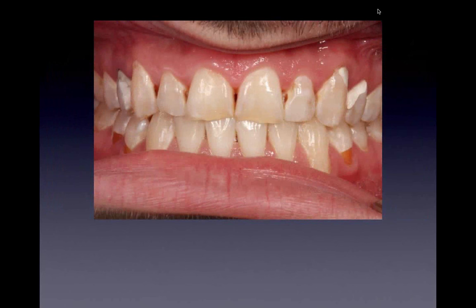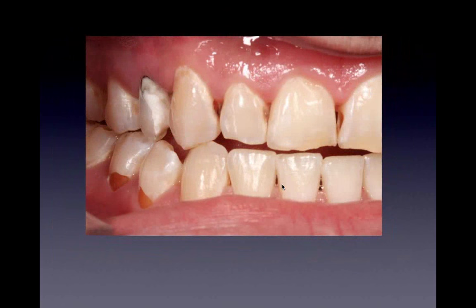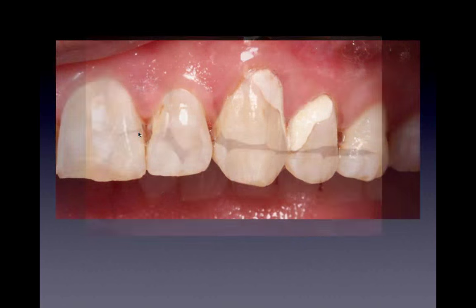Here we have a multiple caries patient. This is multiple units we're doing here. This is where I use the rubber dam. When I'm doing multiple units is when I put the rubber dam on, and we have a lot of decay to get to. We'll go ahead and make sure of his guidance. I'm checking his guidance to see where I'm at. You can see he has a lot of wear on his anteriors here, so I'm really worried about this. He's got some cervical erosions here. I'm looking at the guidance. He's on this premolar. I want to get rid of that. I want to stay on the canine here. I want to get rid of any other contacts posteriorly.